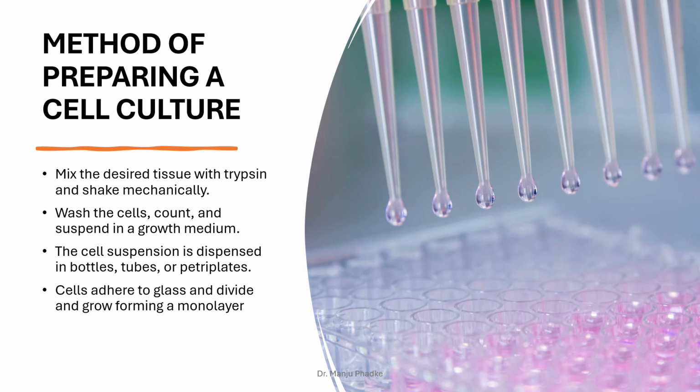The growth medium essentially is composed of essential amino acids, vitamins, salts, glucose, a buffering system, generally a bicarbonate, and there is an atmosphere containing 5% carbon dioxide.